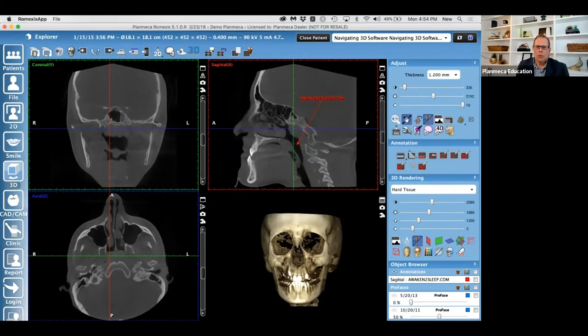Okay, so we'll probably want to save a lot of these details for other courses. We're going to be going over radiation information in our upcoming webinar. So please stay tuned for more detail. So I'm going to give you a fast answer if you can listen fast. I would say a good benchmark, think of the number 20. So 20 microsieverts is typically what a panoramic gives a patient. What's a microsievert? Doesn't matter. You get 8 to 10 microsieverts a day. So for a day's worth of radiation to you or to your patient, think of the number 10. A panoramic is 20, so it's 2 days worth of radiation.